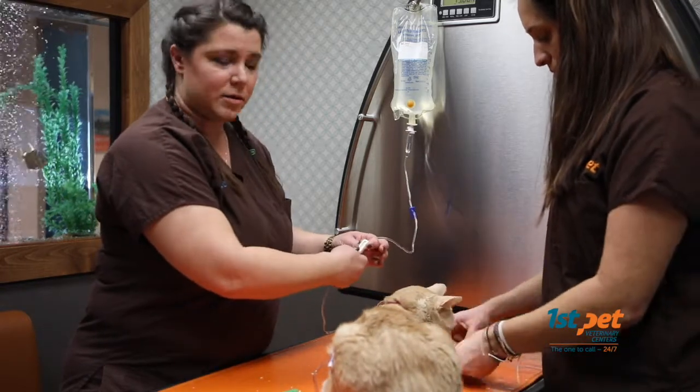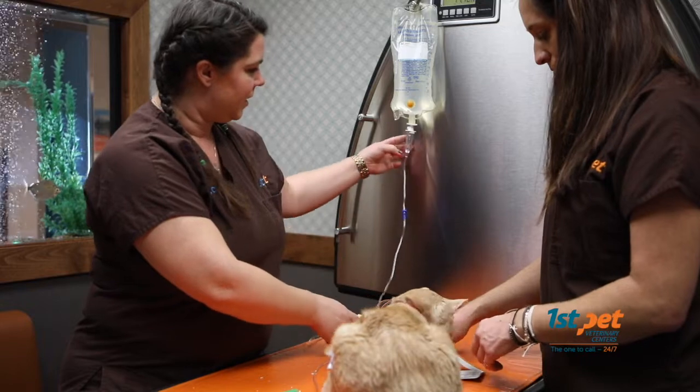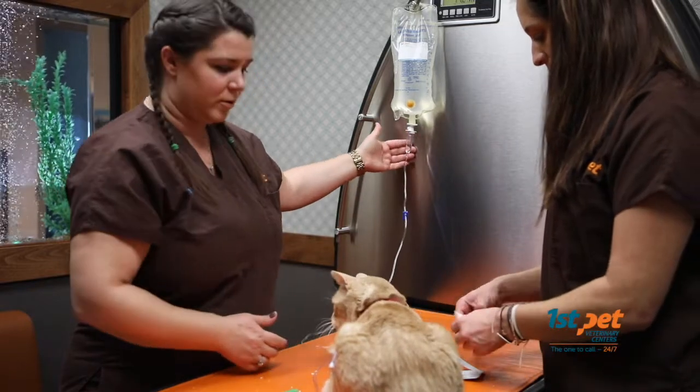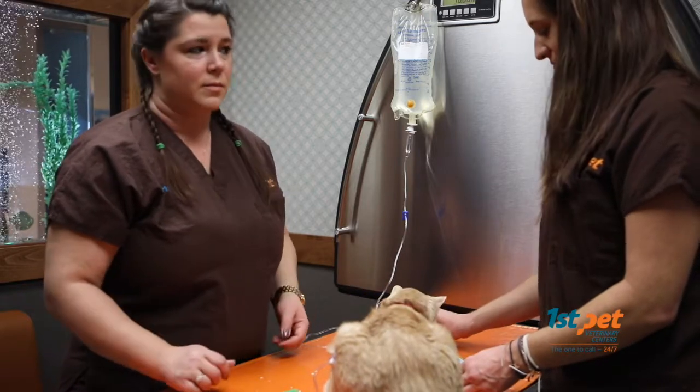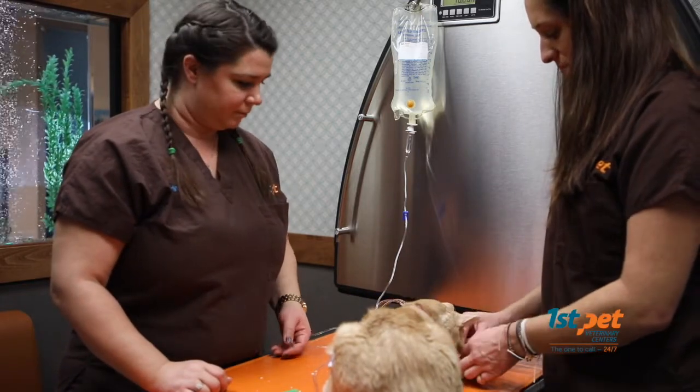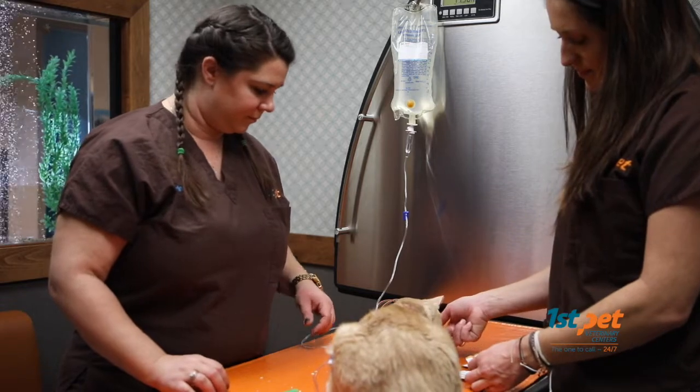Now I'm going to go ahead and turn my fluids on. And if you can see here, the fluids are flowing nicely, and Basil is receiving his fluid treatment.